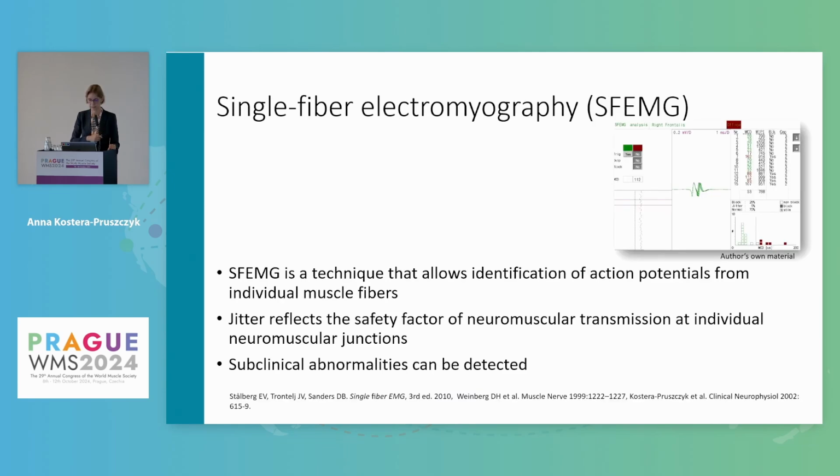Single fiber EMG is a technique that allows identification of single action potentials from individual muscle fibers, and the variability in the time when they occur reflects the safety factor of neuromuscular transmission at the individual neuromuscular junctions, so even subclinical abnormalities can be detected.